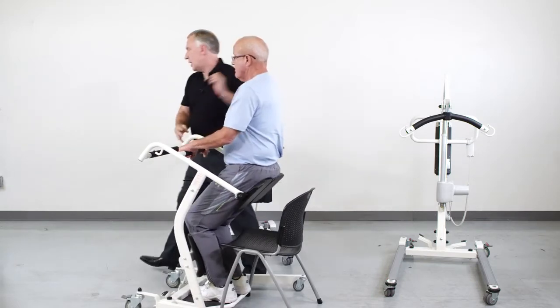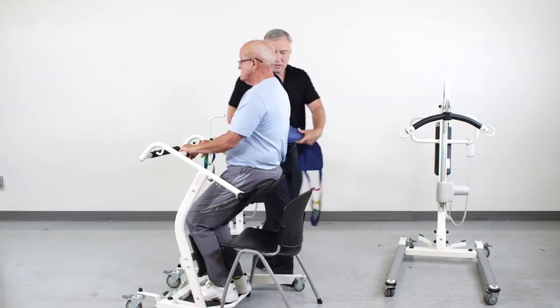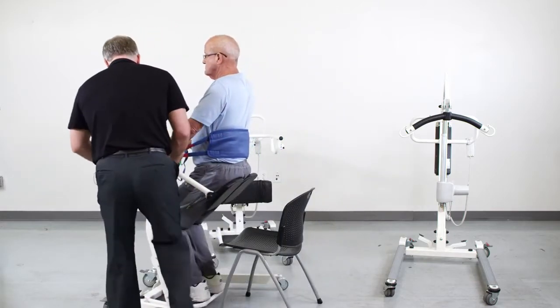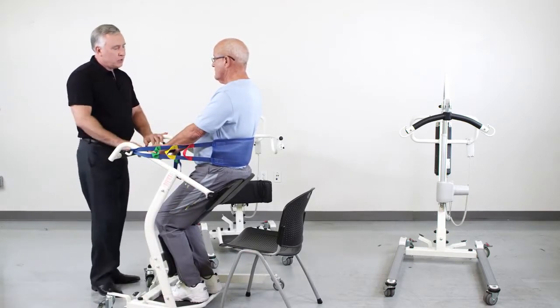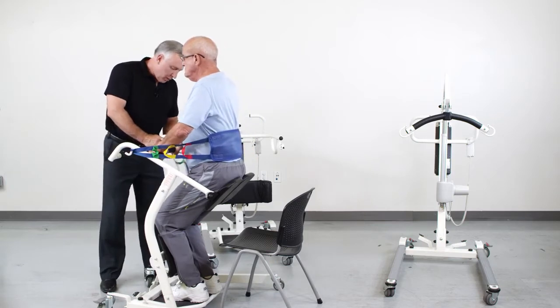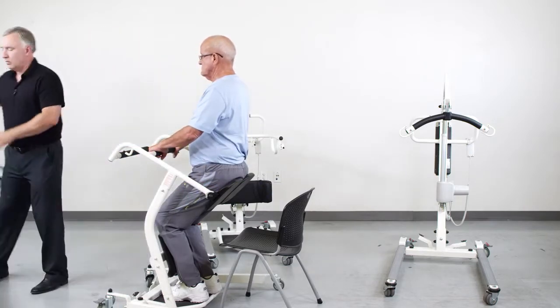If the patient is unstable and needs additional support, we use our support strap and place that behind the patient's back. But as time goes on, the patient's condition could change and they could require more help. So then we can move on to the stand assist device.